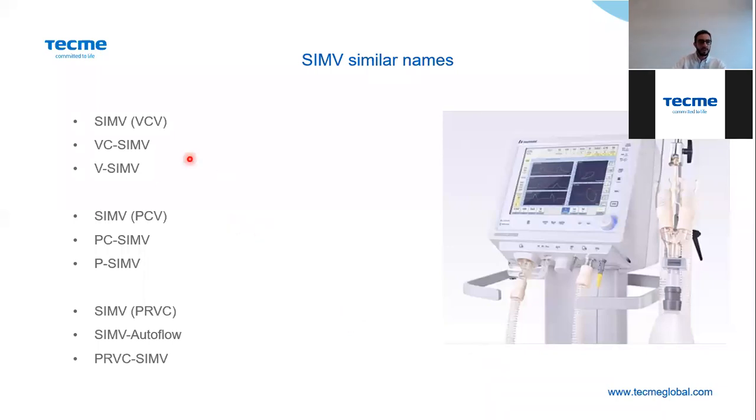Here are some similar names: SIMV VC, SIMV PC, the same with PRVC, SIMV autoflow, or PRVC SIMV.